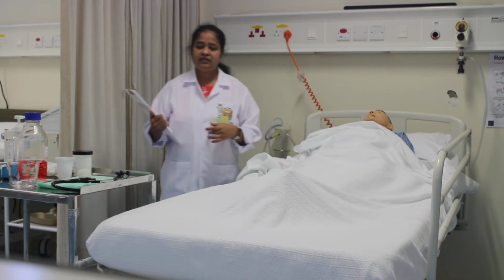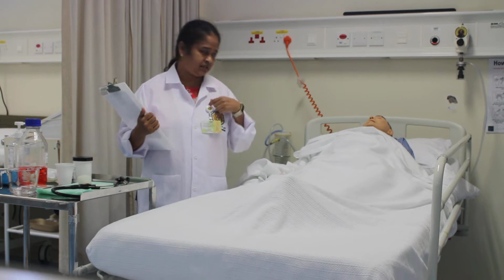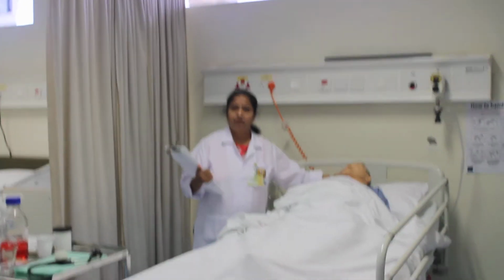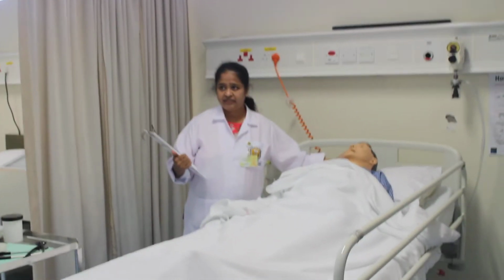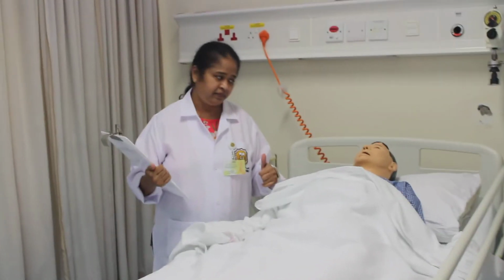Okay, now what are all the things we are going to assess before we put the NG tube into the patient's nose? I want to check whether the patient is able to cooperate, and able to understand what I say. Okay, the patient is conscious, so he can understand and he can cooperate with me.